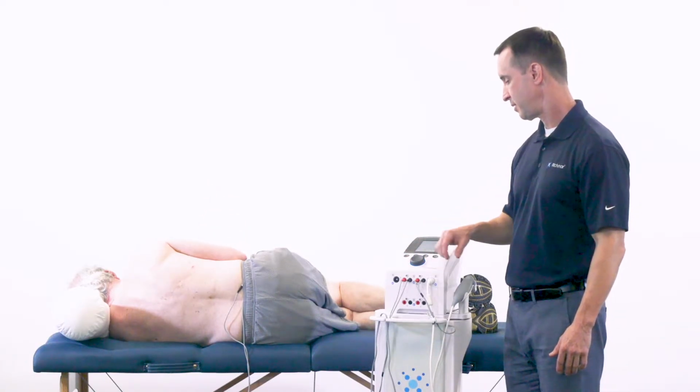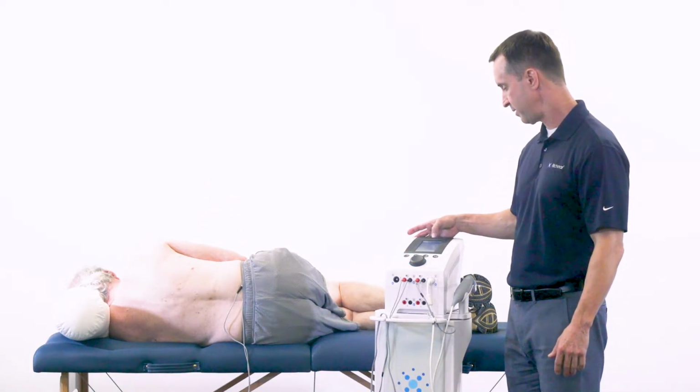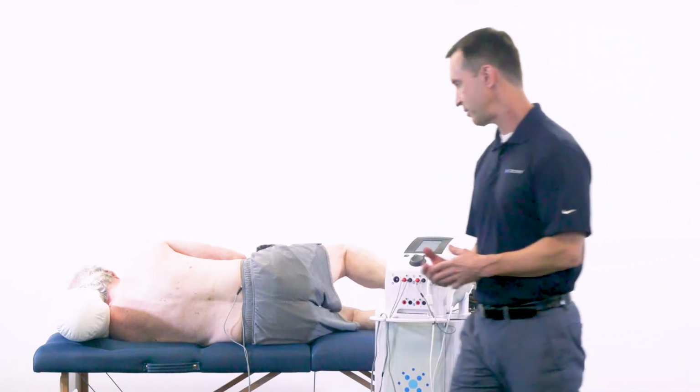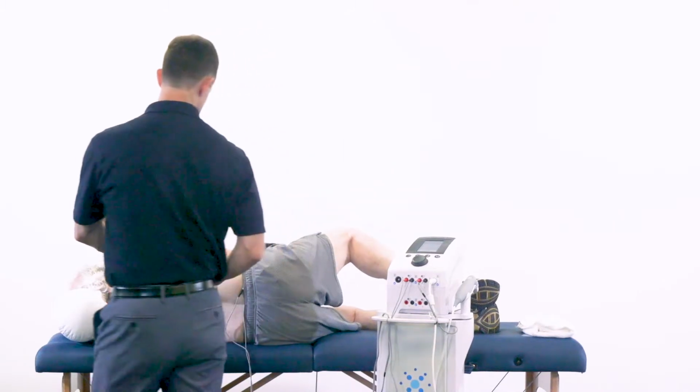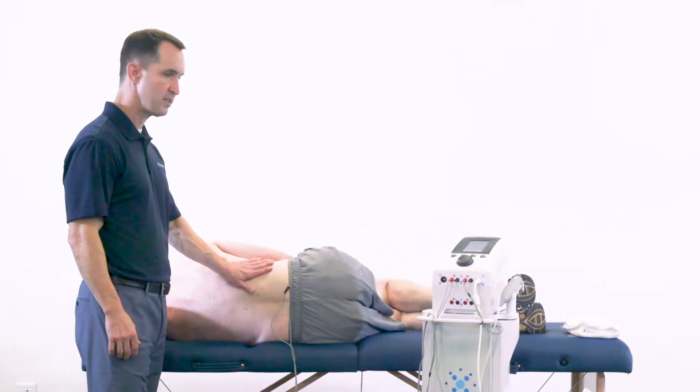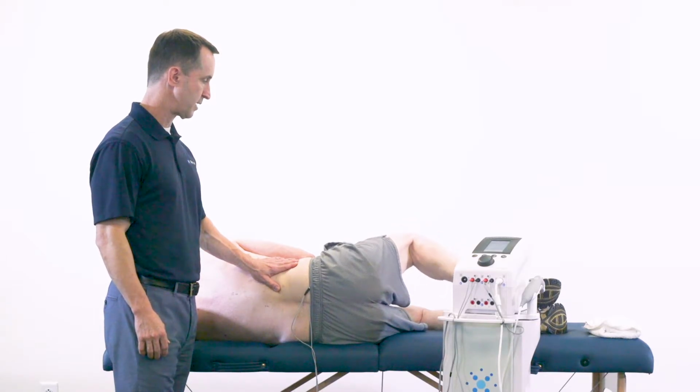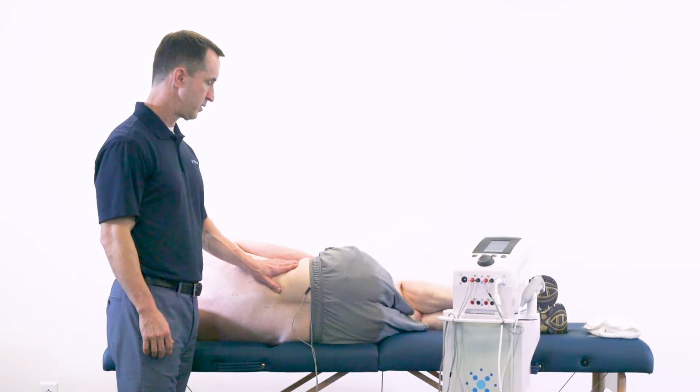Okay, at which point I'm going to push the start button so they can cycle with an on time and off time. And just to ensure that he's focused on the hip and his movements, I'm just going to come over and stabilize his back, making sure he gets good external rotation during that on time.